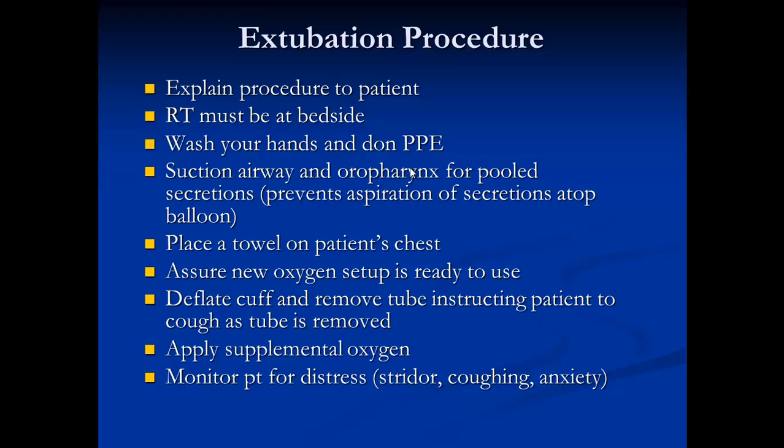Normally, even though the patient is oxygenating properly, the way I order it is, for example, if the patient was already at 35% FiO2 on the mechanical ventilation, I would put Venturi mask 35%, even though the patient's PO2 is 100 and something or 200 and something. I always start at the same FiO2 and wean as tolerated.